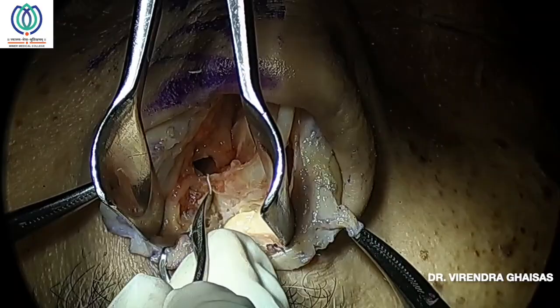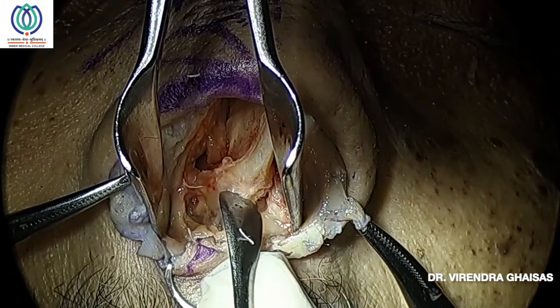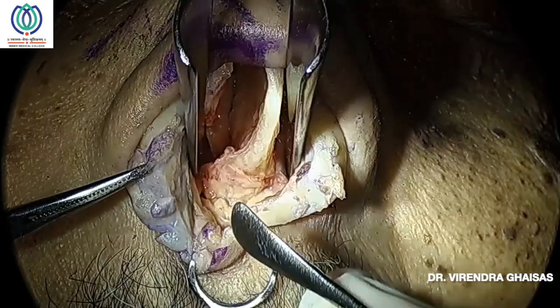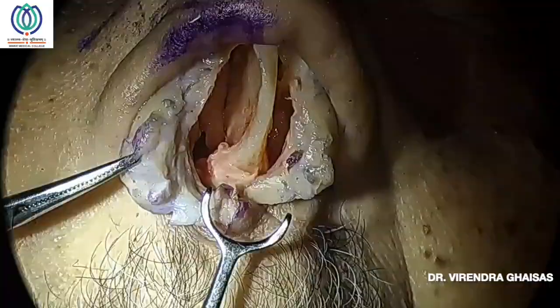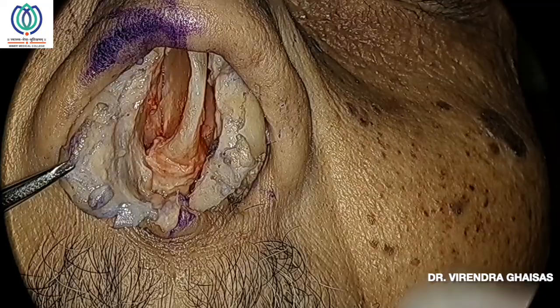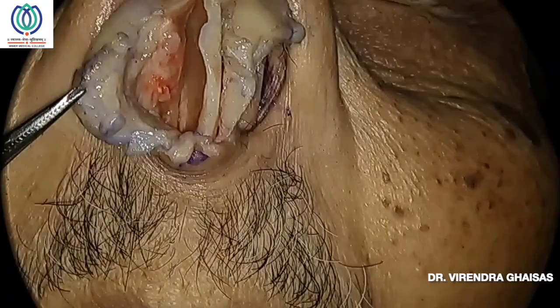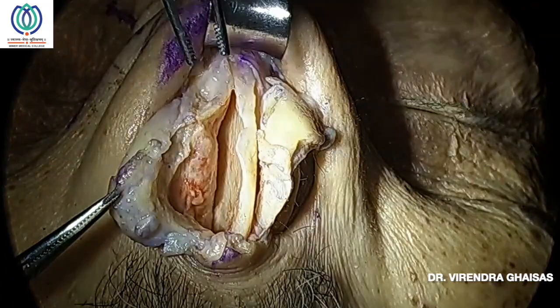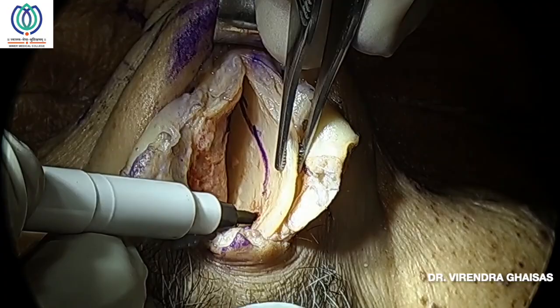An important structure during septoplasty is the anterior nasal spine. It is very important to see the anterior nasal spine in each and every case of deviated noses, in cleft noses too. Especially in patients with a caudal dislocation, the spine is deviated on the same side of the deviation, and the septum is more lateralized to that deviated part of the spine. In many cases you have to either drill the spine or fracture the spine and bring it to the center, keeping one part of the periosteum intact.